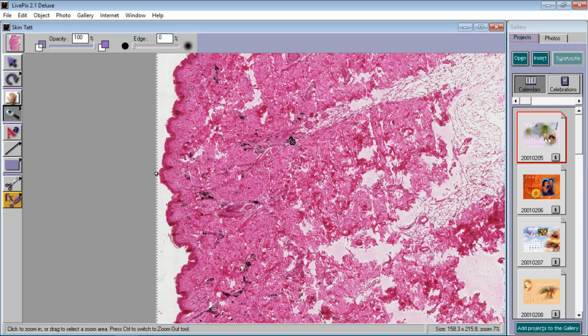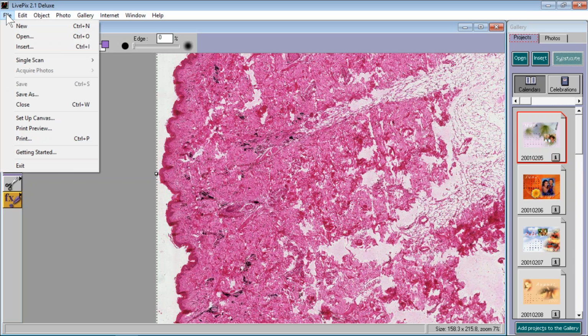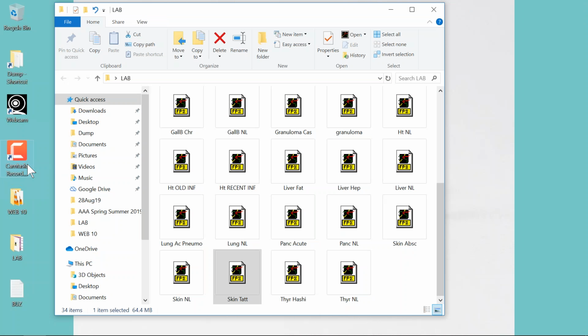And they can make the pulmonary lymph nodes look black as well, also with this very, very dark pigment. But this is probably not anthracosis, because I doubt if this guy was breathing through his pores or his sweat glands. This is a classical tattoo. But anthracosis is another classical example of an exogenous pigment being chewed up by macrophages.